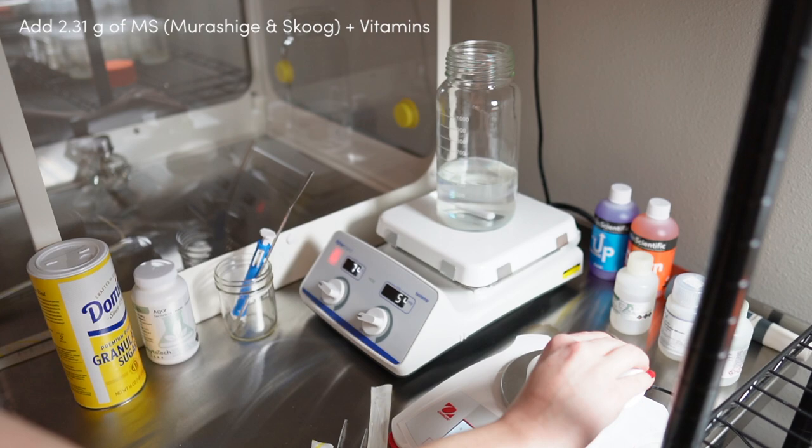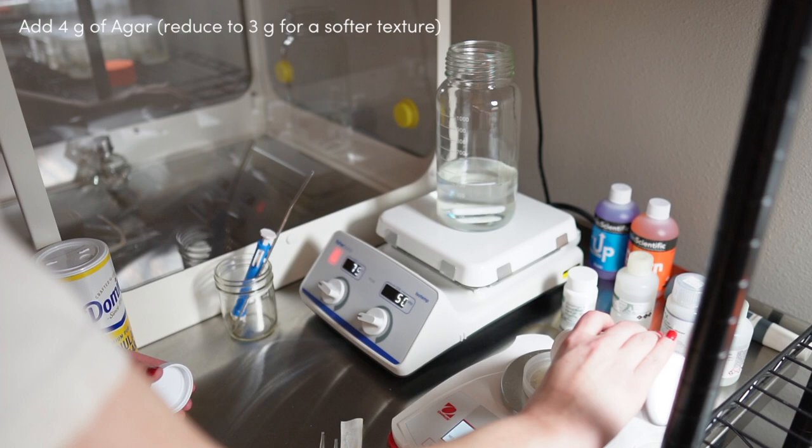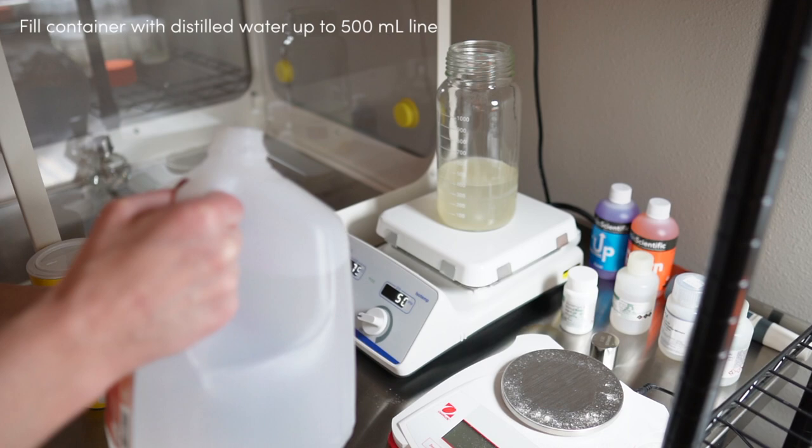I also add 2.3 grams of Murashige and Skoog, as well as 4 grams of agar. The protocol that I'm following actually only calls for 3 grams, but I like my media to be a little firmer. Last time I tried it with 3 grams and it turned out a little too watery for me.